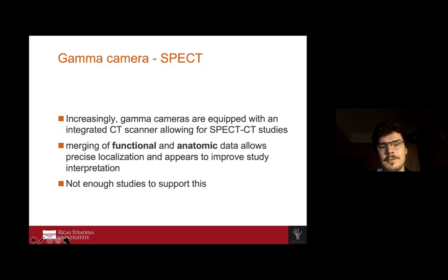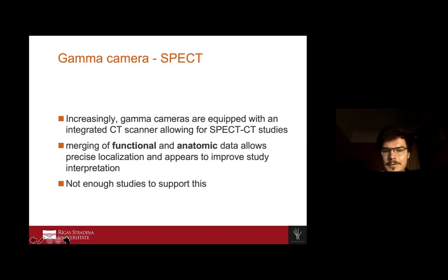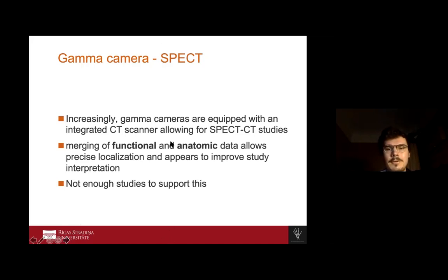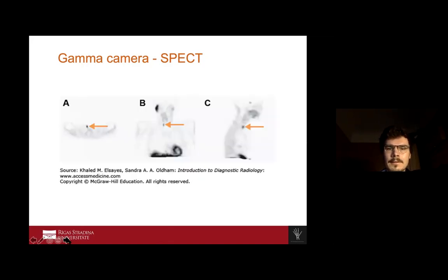We can also combine SPECT with conventional CT, giving us not only functional but also anatomical data, which helps evaluate pathology even better. However, at the moment there are not many studies supporting this method and there is no specific clinical use established yet. Here we see the three planar pictures — axial, coronal, and sagittal.